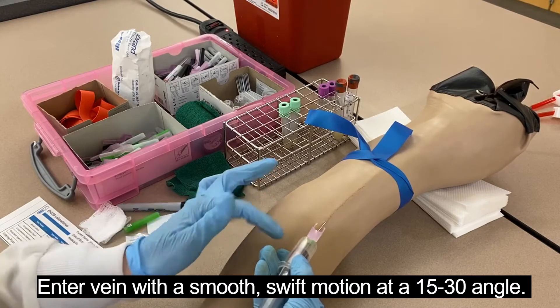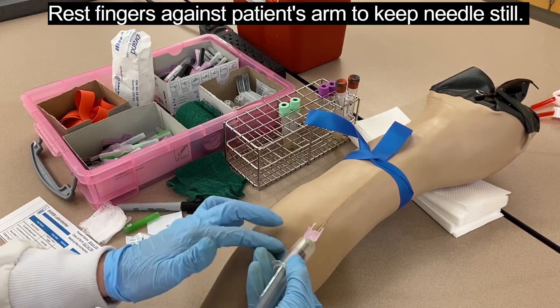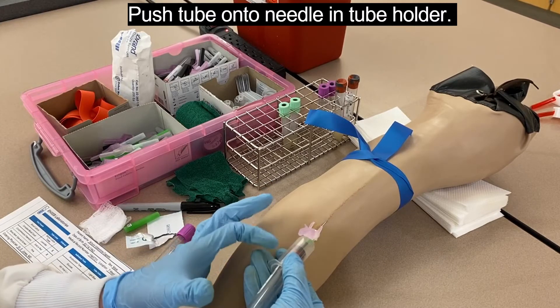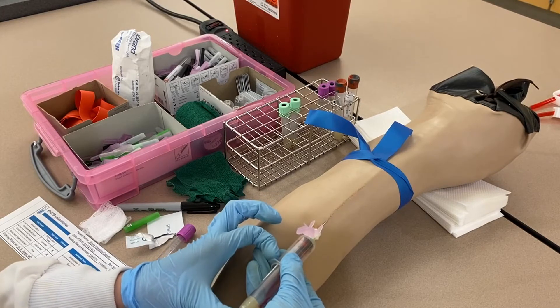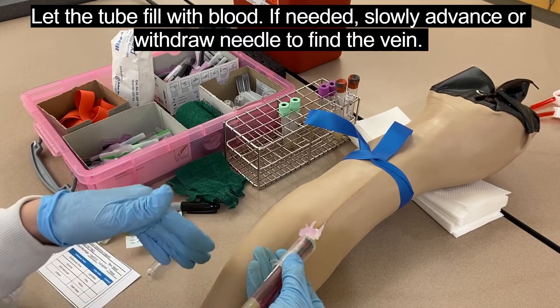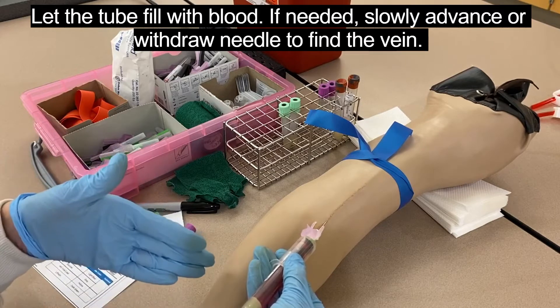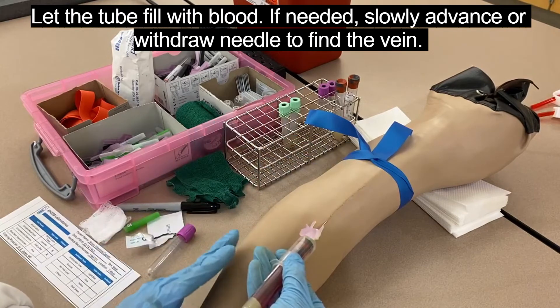Before I pulled back my thumb I rested my finger against his arm, and before I push the tube on I make sure this finger is resting against his arm — that prevents the needle from moving. To push the tube on, I have my thumb of my non-dominant hand against the bottom of the tube, my index finger against the ledge of the tube holder, and I pinch them together. The tube is filling, which means I'm in the vein. If I weren't, I could try advancing or drawing the needle back slightly — but don't go fishing in different directions, only forward and back.